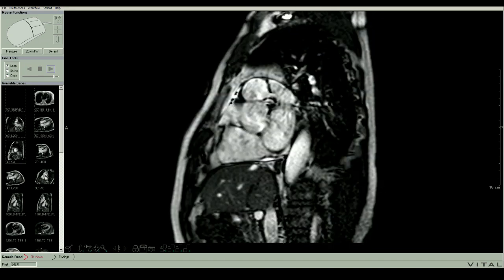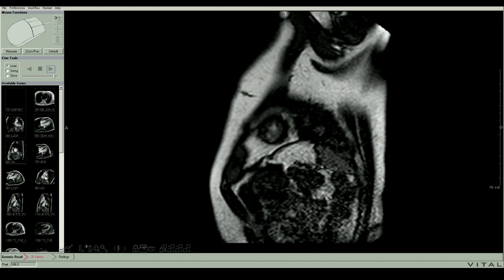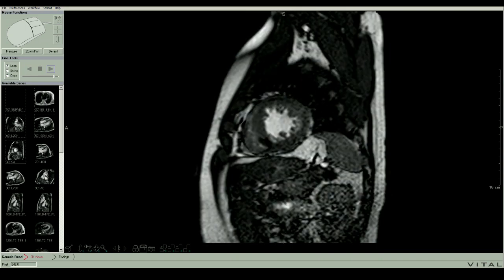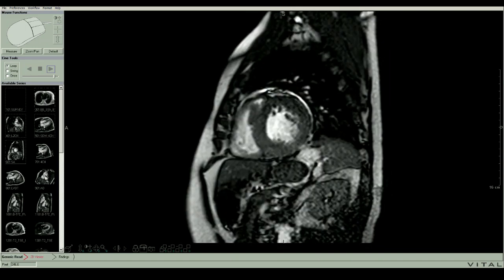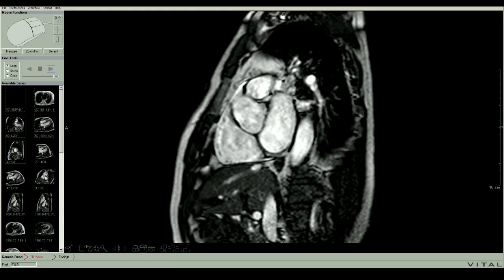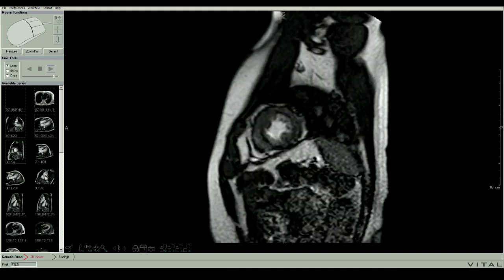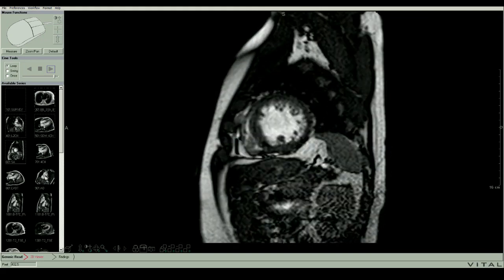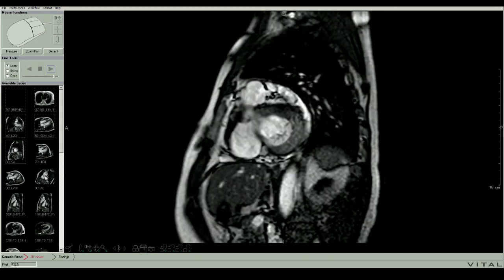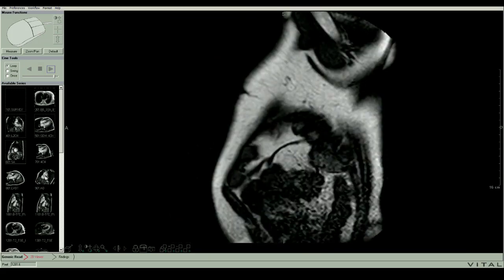And looking at these images, this is the stack. This is a stack of short axis images from which we calculate the ejection fraction, which is the gold standard for ejection fractions because it's 3D. And it's a stack of images with very well documented endocardium. So that's how this got the claim to be the gold standard for ejection fraction, and it is. There are some areas that aren't beating well or even distorting in terms of their conformation. They're not changing. So it looks regional, although we know there's no coronary disease.